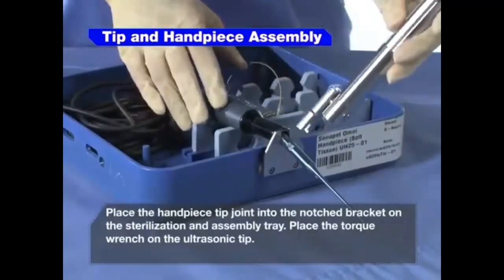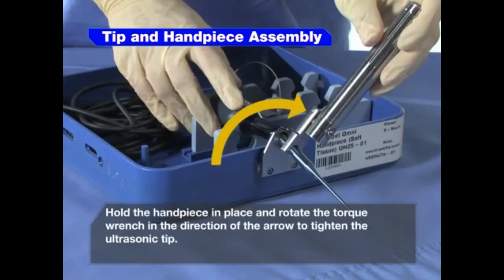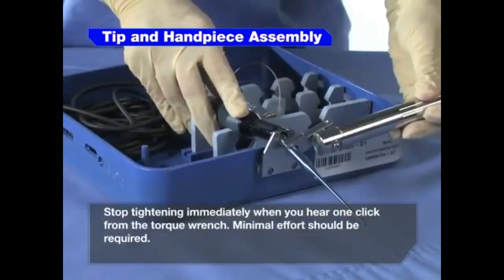Place the torque wrench on the ultrasonic tip. The side of the torque wrench with the arrow symbol must face the distal end of the tip. Hold the handpiece in place and rotate the torque wrench in the direction of the arrow to tighten the ultrasonic tip. Stop tightening immediately when you hear one click from the torque wrench.